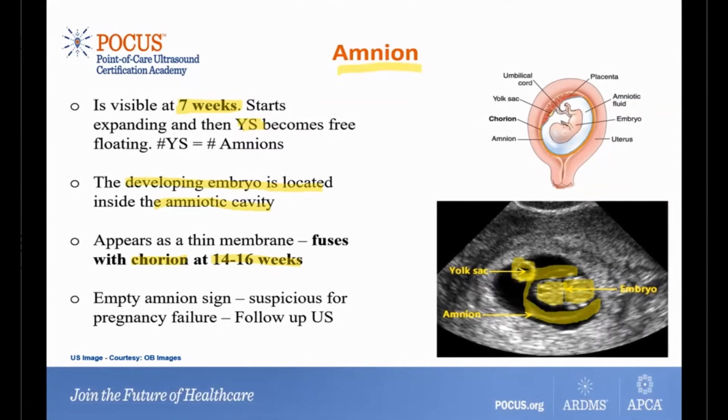And the empty amnion sign is suspicious for pregnancy failure. So definitely do a follow-up ultrasound if you do not see an embryo within the amniotic cavity.